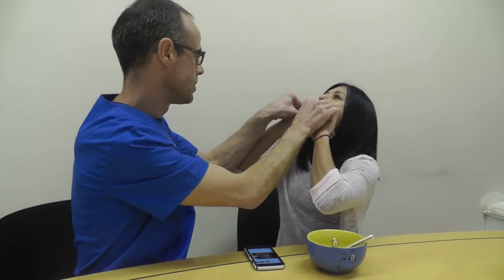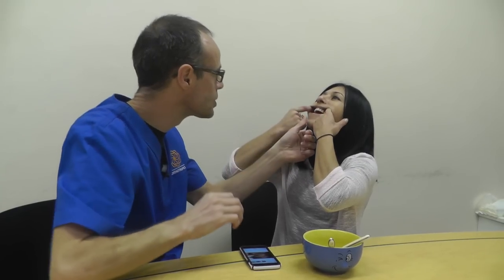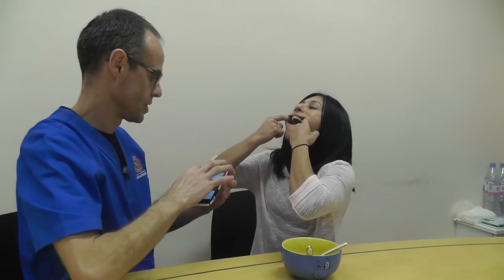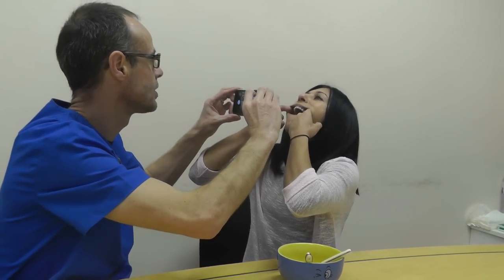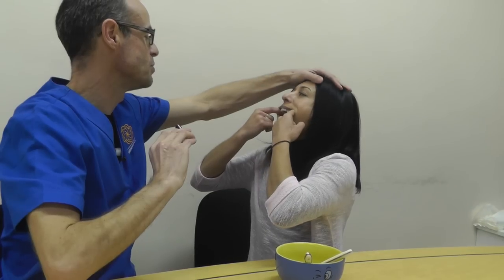Put the two fingers in here, move the two fingers forward, just about that. Open nice and wide — fantastic. Come back to camera, head back a little bit further, move your hand away. Hold your head like that, move your arm away, like this.